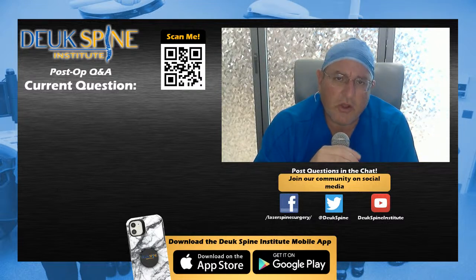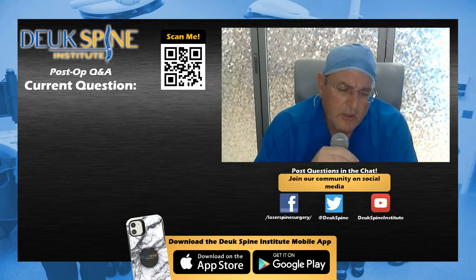You could see there was a lot of scar tissue on the dura. That's from the inflammation on the dura from the arthritis of the spine, for lack of a better word, inflammation on the spine with the ligament, the facets, the disc, all causing basically scarring of the dura, which is why it had that really weird reddish gray appearance. It was all scar tissue and blood vessels feeding the inflammation. So I think he's going to do well.